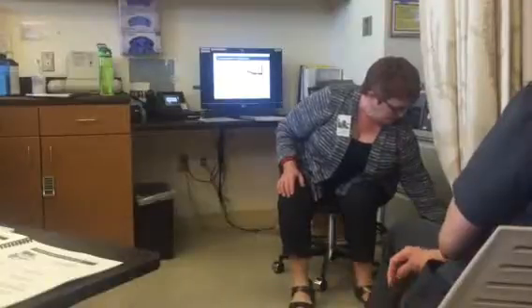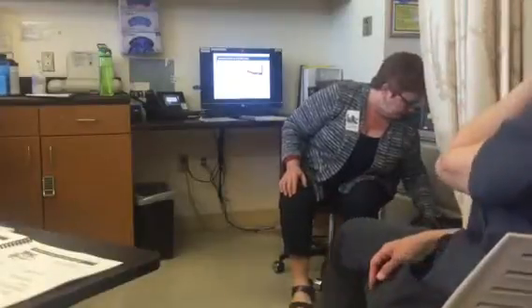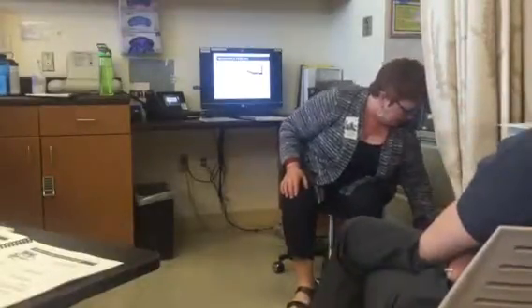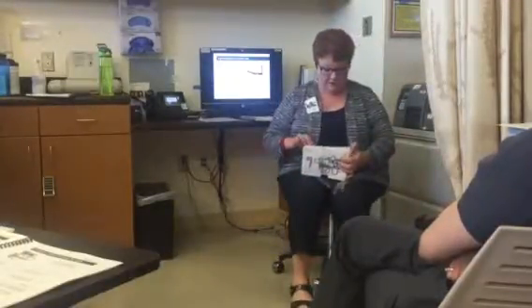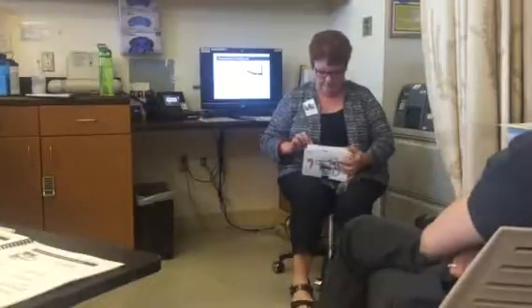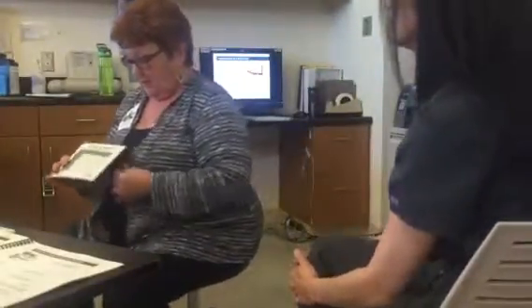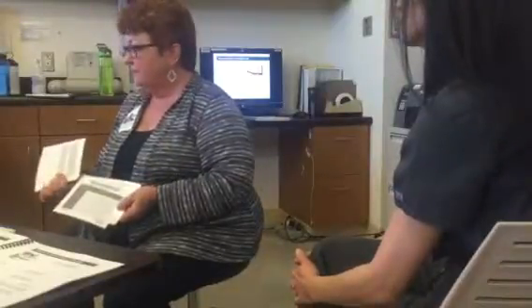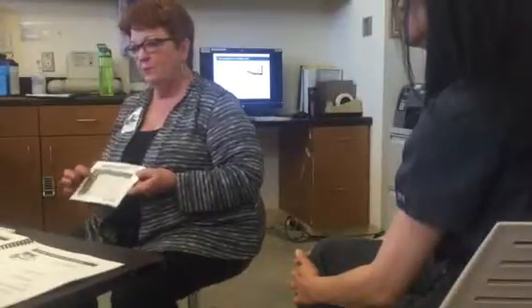So one of the things that you can do to avoid accumulation of a buffy coat is to use this little tool that the engineers have given us. And this tool is an optimization tool for the collect pump flow rate, all right? And it says that all of the caveats are in the back. It asks you to look at your patient's white count today, not MNC, but white count. It asks what your inlet pump flow rate will be.